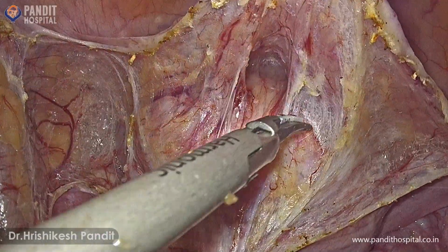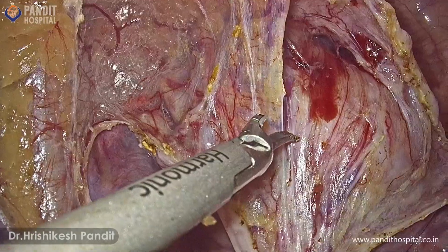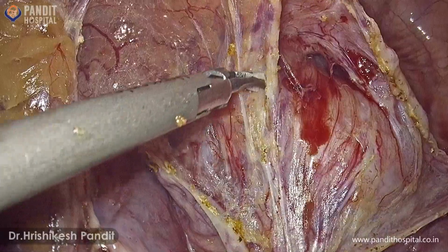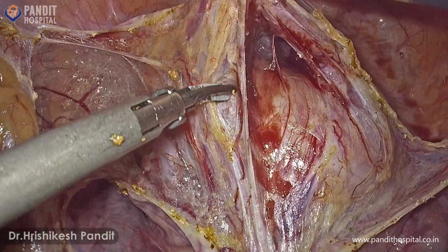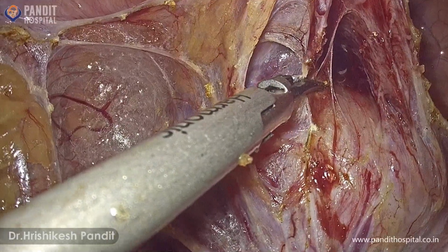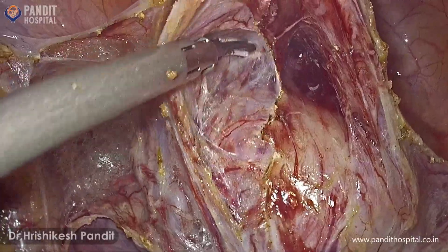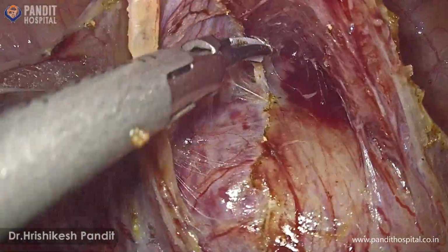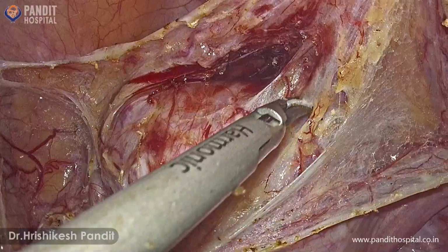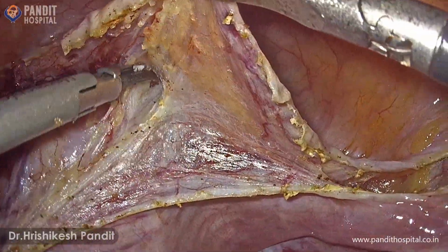Respect is given to each capillary to prevent bleeding and soiling of the field. Bladder is gently pushed down caudally so as to expose at least 2 cm of vagina to get an adequate tumor-free margin of specimen. Here we are dissecting the bladder pillars, that are bladder strands above the uterine artery.